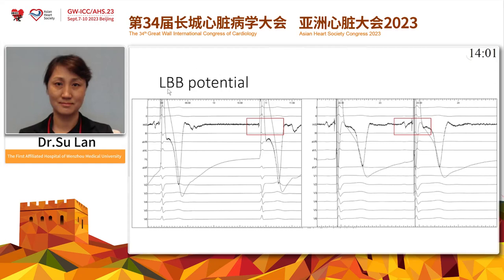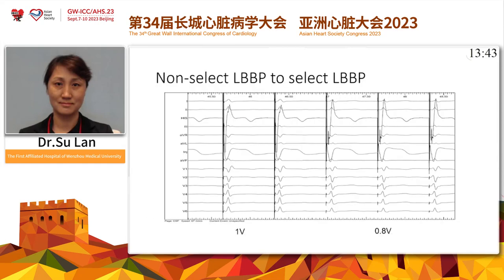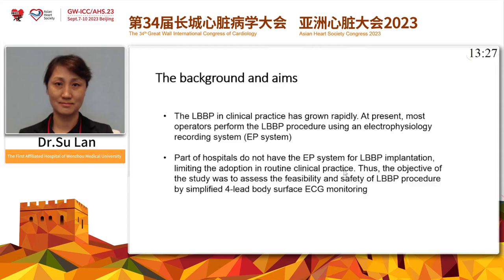We can observe different LBB potentials from small potential without injury current to big LBB potential with injury current at deeper septal positions. With a better threshold of LBB capture, this represents the transition from non-selective to selective LBB pacing. Decreasing the output from 1.0 volts to 0.8 volts still gives the same LVAT time.